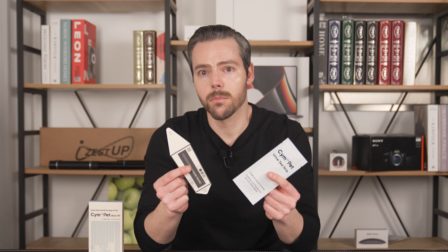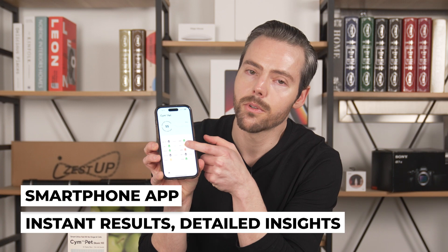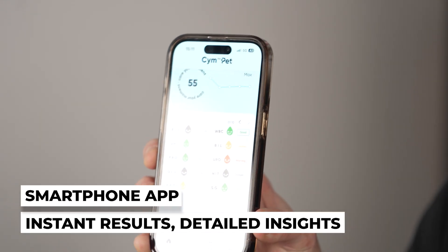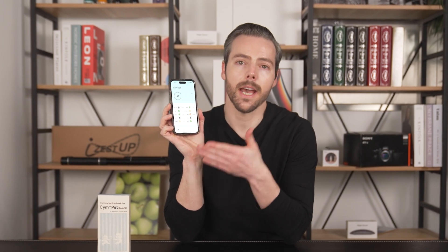Let's talk about what it's supposed to do. It's supposed to monitor your pet's blood, protein intake, that sort of stuff — basically a snapshot of how your pet is at any given moment. Once you take a sample from your pet, you analyze it on your smartphone and it gives you detailed charts and graphs about your pet's results so you can track them across several days. Basically the test strip gets the sample and the app analyzes it.